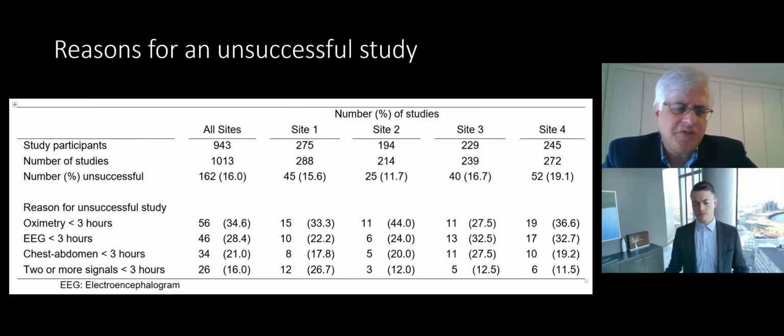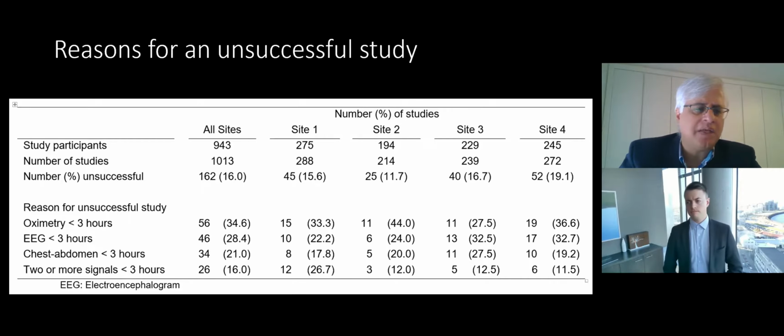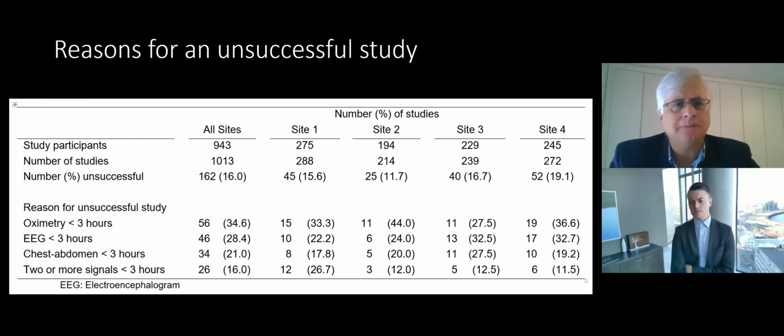So the message here to take away is that, yes, one can do polysomnography, including the EEG, at home. The trouble is not so much the EEG, which I think has been done well here. The trouble really is everything else, which is a problem no matter what. I mean, if you were to think about any respiratory approach to understanding sleep and breathing at home, you're going to see the same challenges.